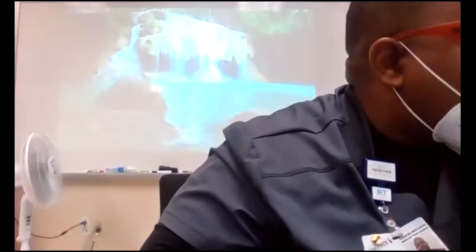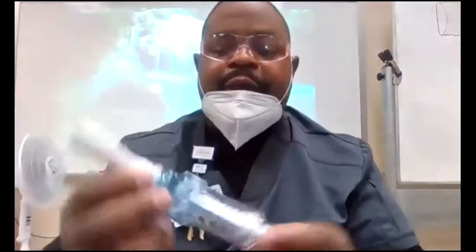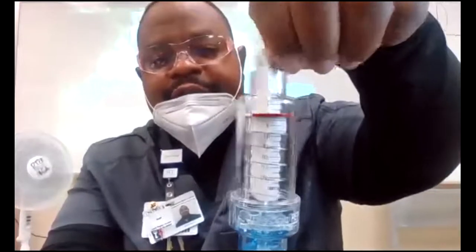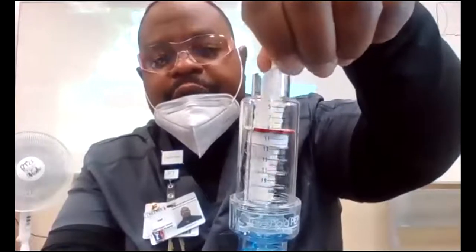Then we have what's called PEP therapy. Positive expiratory pressure. Now, I can either use the flutter mechanism, or I can use a constant back pressure. This is called the PEP device. See the centimeters of water pressure? I can set that by turning this. So I turn this and that red line goes down to whatever pressure I'm trying to set.